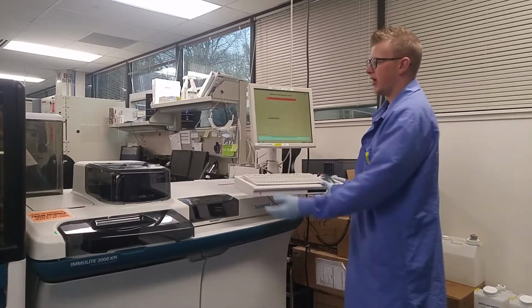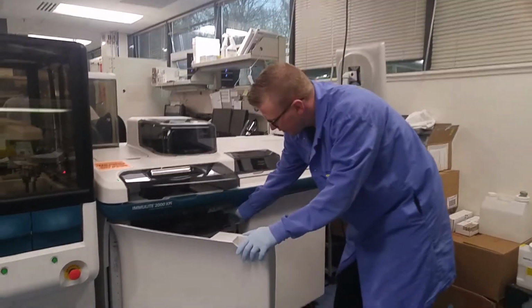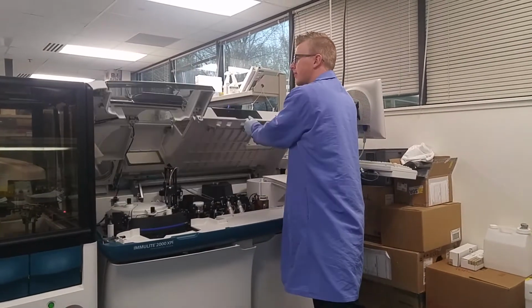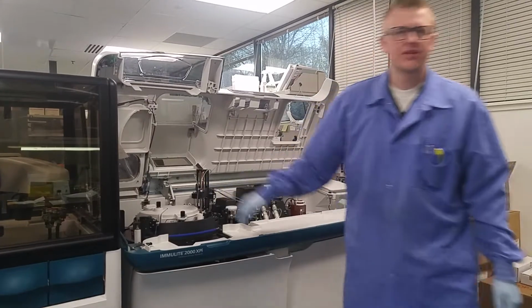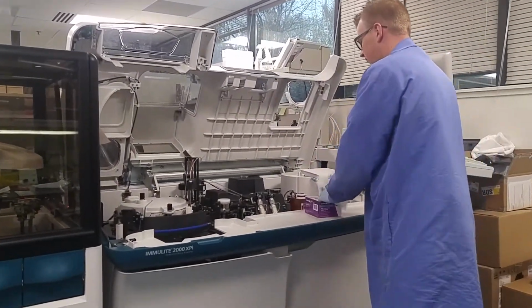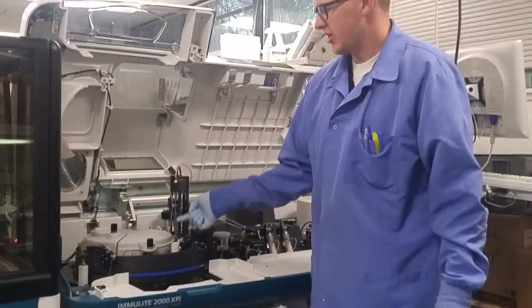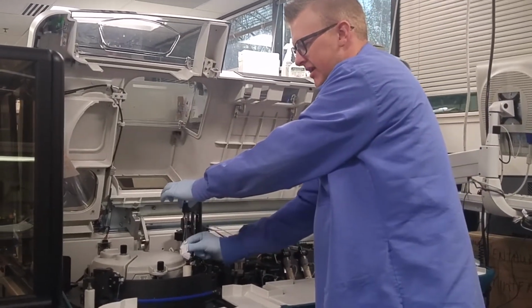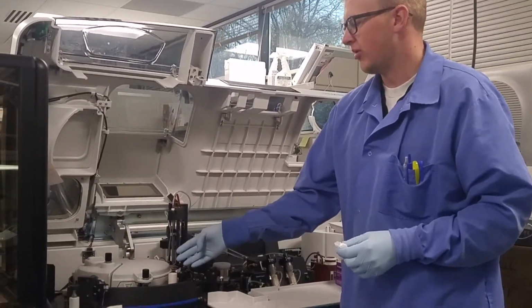At this point, we're going to open up the screen door, pull the lever. So this would be the probe that you encounter the Clot on. So you're going to grab yourself a Kim wipe. You're going to gently lift up the arm and check for any Clot along the probe. Grab your Kim wipe, you're just going to slide it all the way down to remove any Clot material that might have been detected on the external probe.